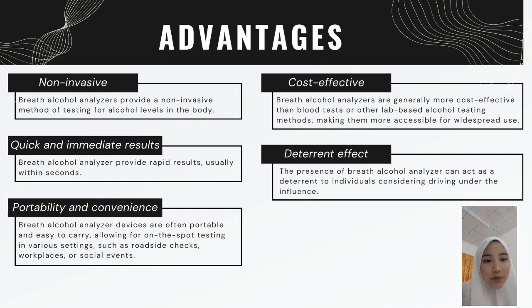The third is portability and convenience. Breath alcohol analyzer devices are often portable and easy to carry, allowing for on-the-spot testing in various settings such as roadside checks, workplace, or social events. For the fourth is cost-effective.